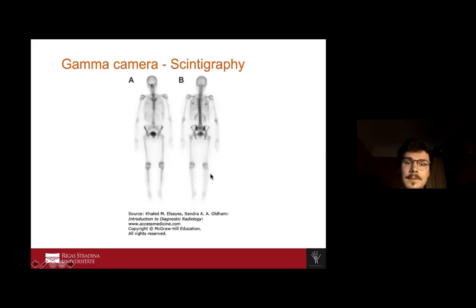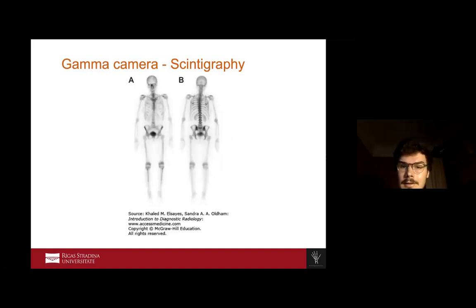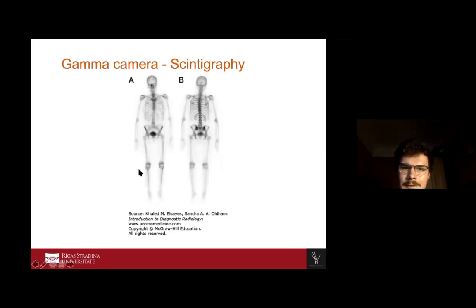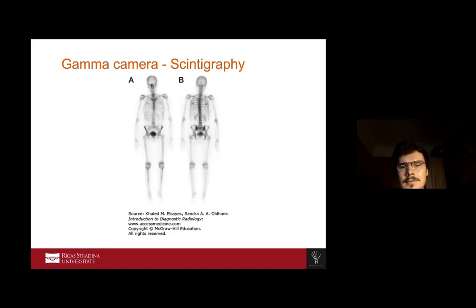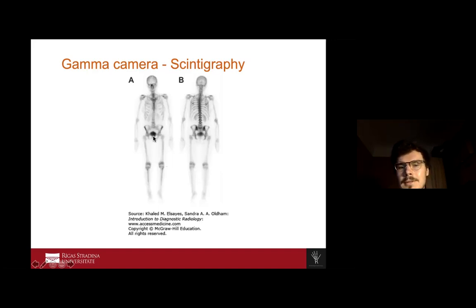Here is an example of scintigraphy. This patient is a woman with a relapse of breast cancer, and a tracer was used to track down osseous metastasis — any bone metastasis of the breast cancer. As we can see, there is no remarkable part on the bones, nothing suspicious, and no metastasis located in the bones yet. We must always be careful that the bladder is often very dark on scintigraphy, but this is normal for this imaging technique.